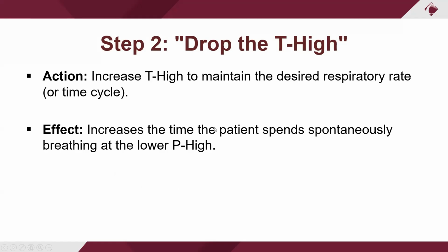Some patients, like that patient that I showed you the video of, who was releasing 900 tidal volume, that's actually a good example. When I looked at that, I thought, why aren't we weaning this patient? Because if somebody's opened up and recruited, and this is the way you've got to think about it, if they're exhaling 900 tidal volume in half a second, what's their overall lung volume? We're probably at a point where we're almost over-distending them. That tells me they should have been weaned already. They should have been dropped and stretched out and ready to go instead of just breathing in. They're still kind of on that control side, and you've got to get them down to that interactive side.